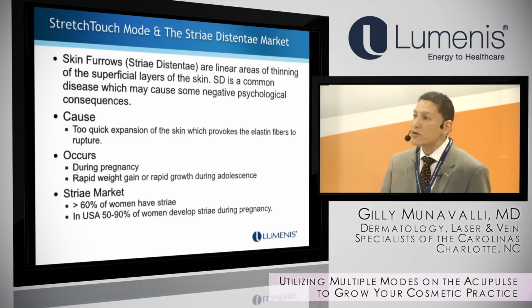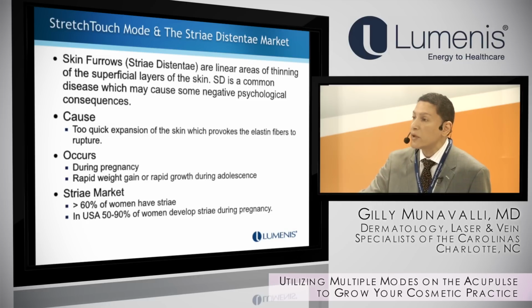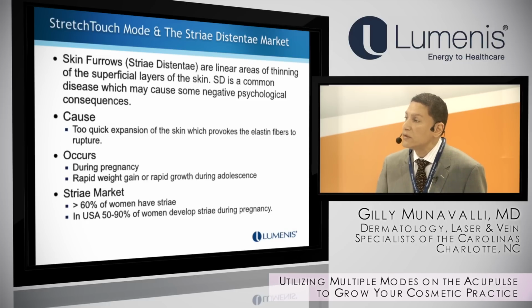Typically, it's either large, rapid weight gain or weight loss, which you'll see during pregnancy. You can see it in bodybuilders, young adults, female and male, that just expand their body mass too high. It's a big problem, and there's really not a good solution for it right now. So I prefer to use CO2 over the non-ablative wavelengths just because of the heat that it generates.